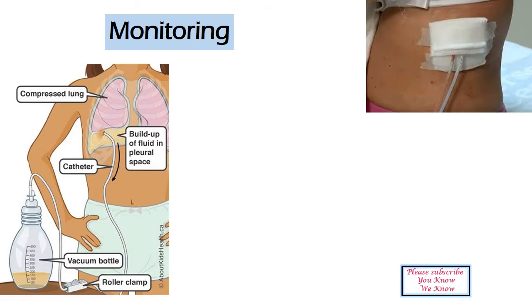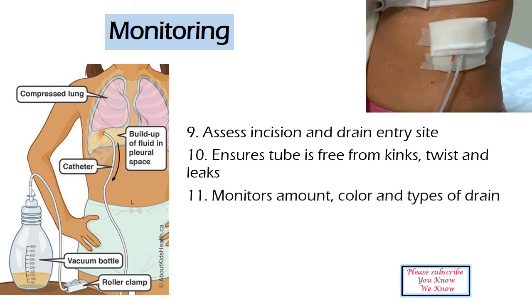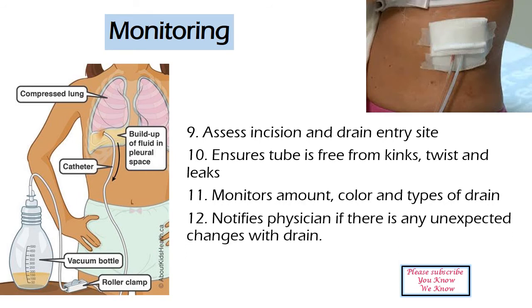Monitoring the patient with the drain is very essential. Assess the incision and drain entry site. Ensure the tube is free from kinks, twists and leaks. Monitor the amount, color and type of drainage. Notify the physician if there are any unexpected changes with the drain.